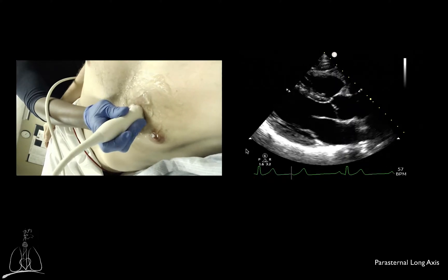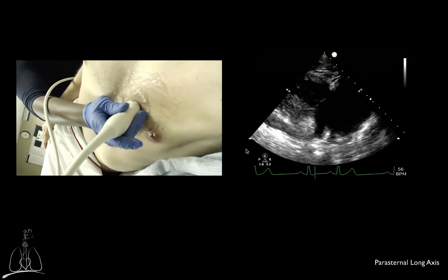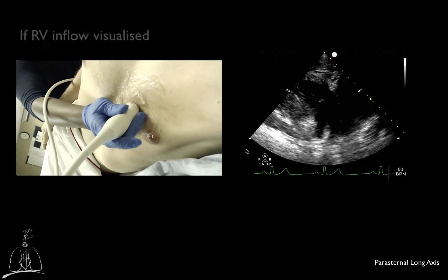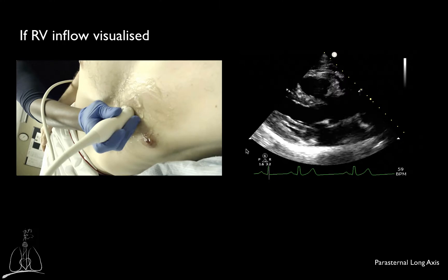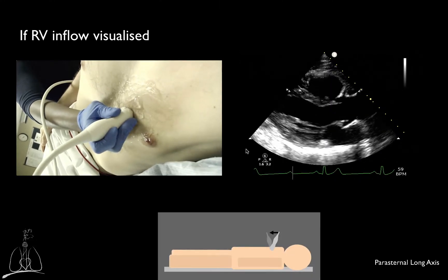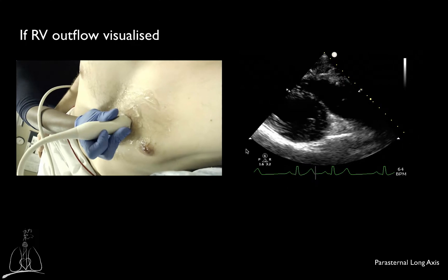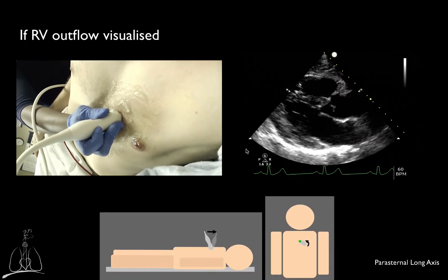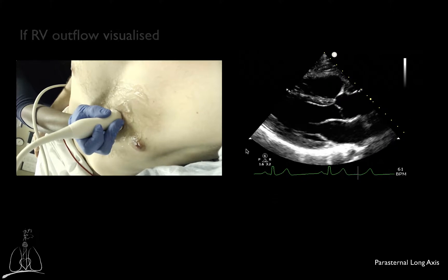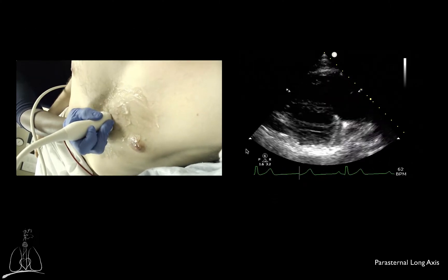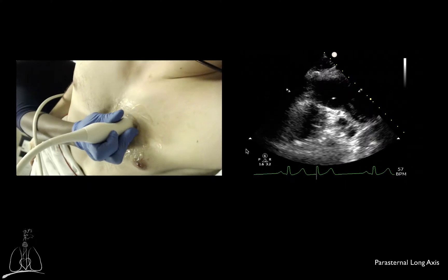Sometimes you will obtain images that identify structures that should not be insonated in a true parasternal long axis view. For example, from the parasternal long axis view, you may see the right ventricular outflow and inflow views. If, while trying to obtain the parasternal long axis view, you start seeing the right ventricular inflow tract, you should tilt the footprint of the transducer downwards and/or rotate the transducer counterclockwise by a few degrees. It is more likely to insonate the right ventricular inflow tract if you position the transducer on a lower intercostal space, while you are more likely to see the right ventricular outflow tract if you slide the transducer higher on the chest.